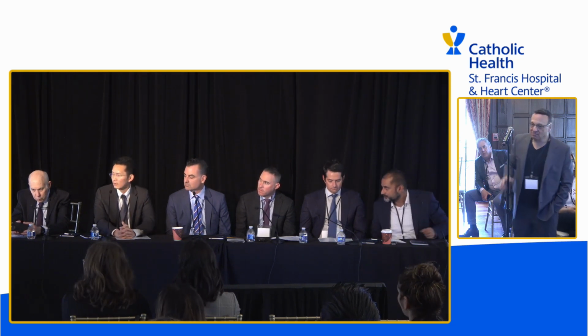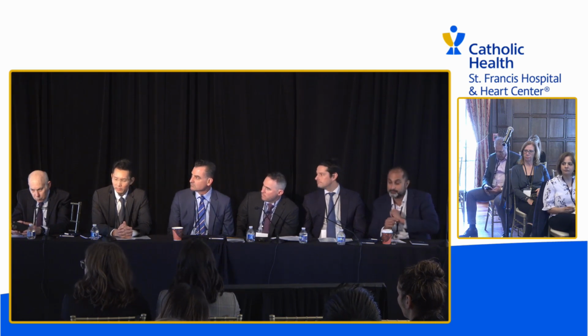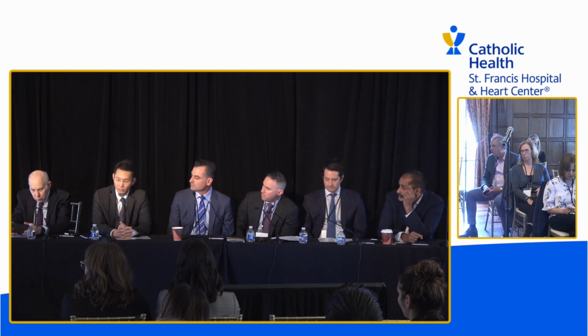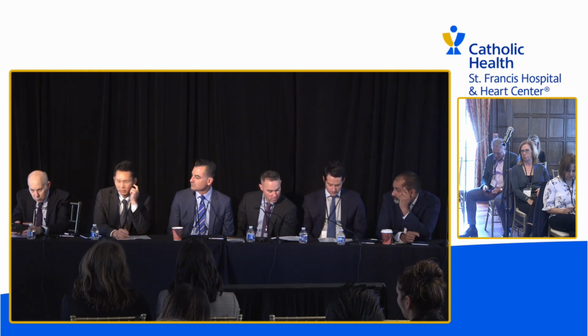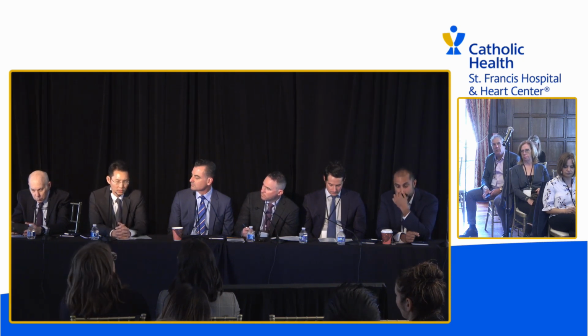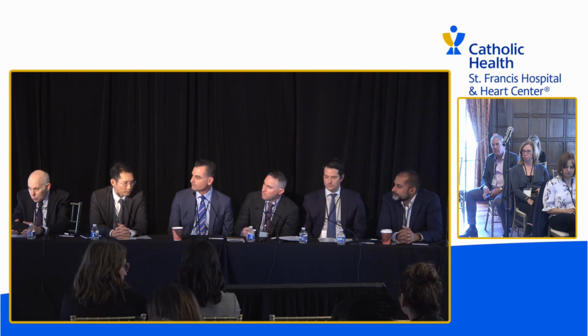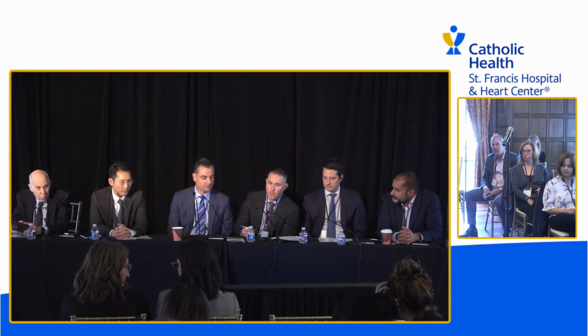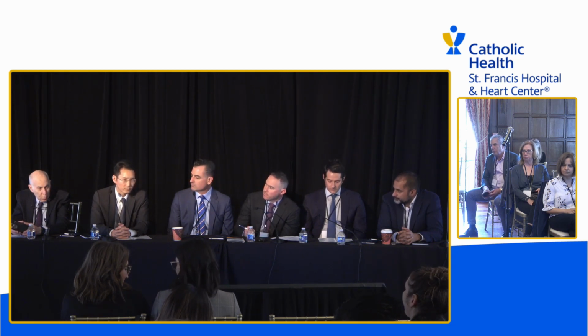Great. Yeah, I think it's an important point. It's good to have a plan of what to do with the mitral, even after you treat the aortic. The patient had a TEE and a CTA, so you probably could get a good sense if you could treat it with a TEER mitral clip or TMVR. A lot of patients do really well afterwards, and they don't need the mitral treated, so we would watch.